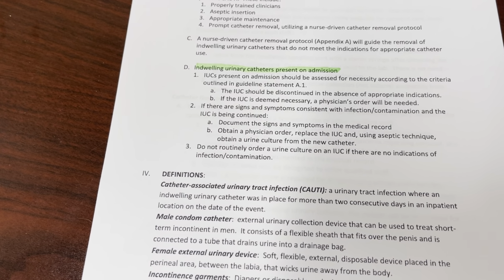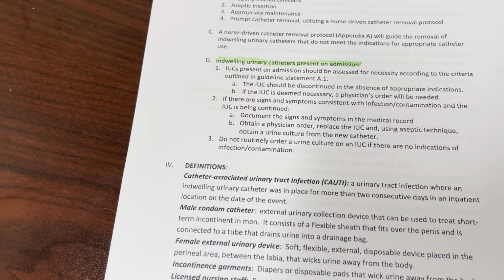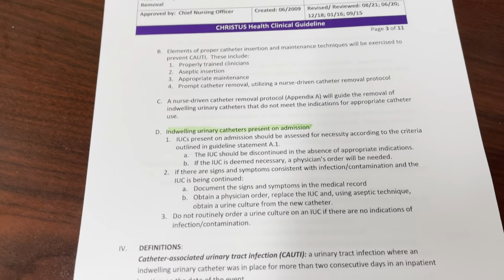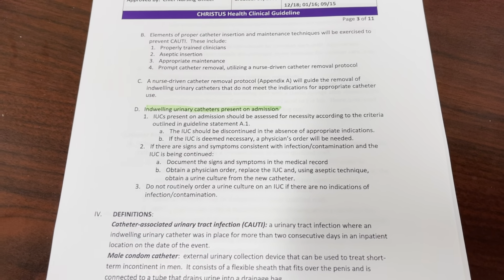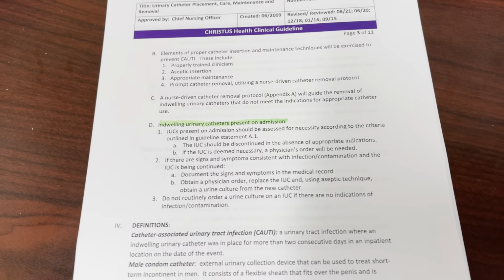And then once the catheter is changed, we also need to send a sample to the lab so that we can get a lab run to make sure that there's not any kind of bacteria or growth in their urine. That way, if they come in with a UTI, we can go ahead and get them on treatment, and that we also don't get labeled with a CAUTI for a Foley that came into our facility from outside.